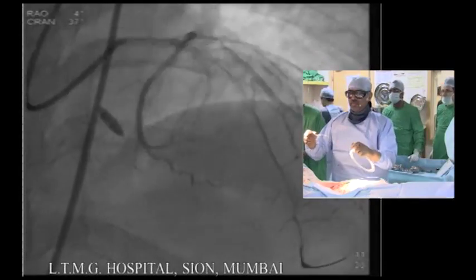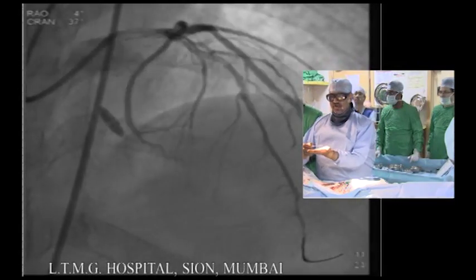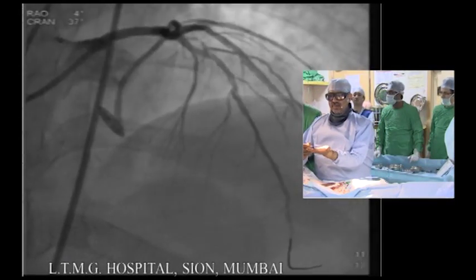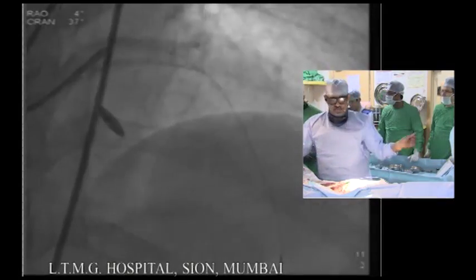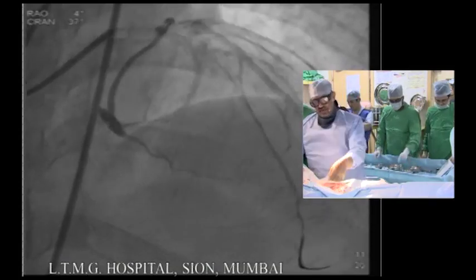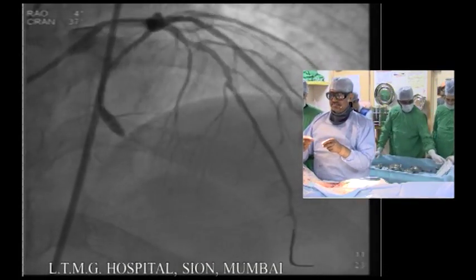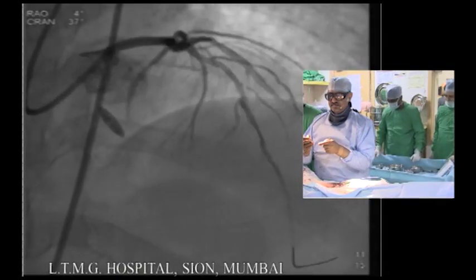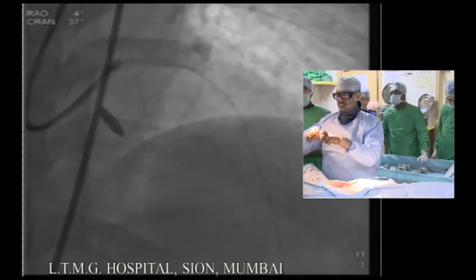So the plan is to put a long stent. The length is 60 and it is tapering 3 by 2.5 and then we can post dilate approximately 3.25 or 3.5 and distally up to 2.75. No. Okay, the concern in the panel is, I think most people here would like to image the artery.